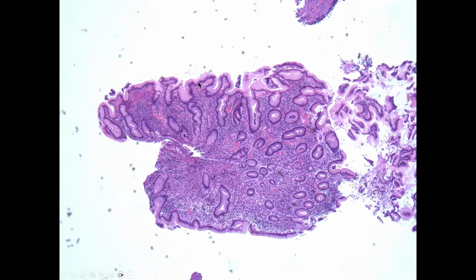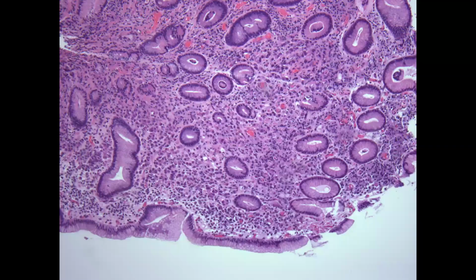This is another example of a gastric biopsy where the lamina propria is expanded. And so again, just like last time, we see a lot of blue cells in between the glands here instead of the tightly packed back-to-back glands that we should see. And so again, you want to go in on higher power and see what's going on. And so we look in here, okay, definitely increased cellularity between these glands. I can't quite tell what they are.